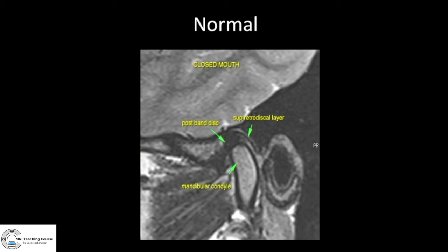Now let's look at normal and abnormal. On the normal sagittal PD image, you can see the mandibular condyle and the articular disc — it looks just like a knee meniscus. It's fibrous tissue so it appears dark, with a bow-tie-like appearance. The normal position of the articular disc is such that the posterior portion — not the central portion — is above the mandibular condyle.